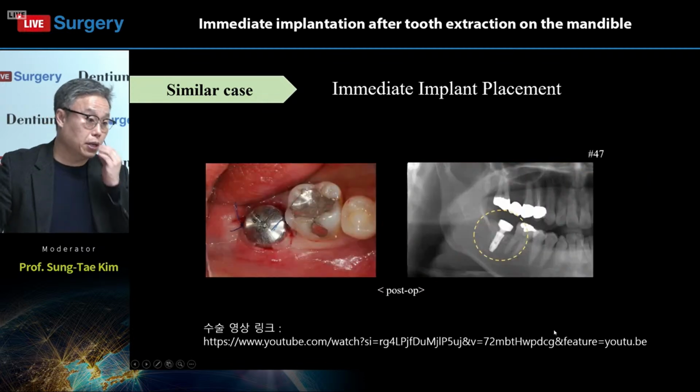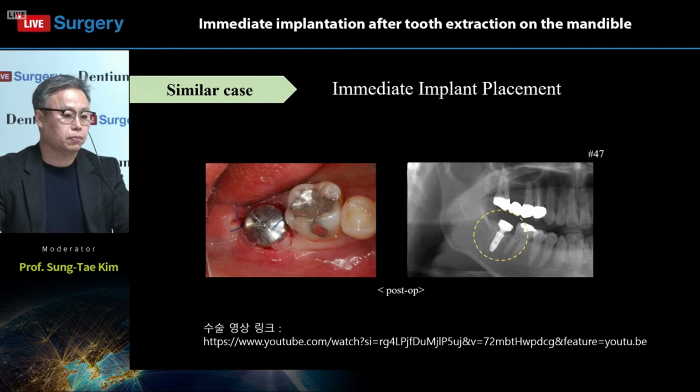You can also find the video following this link, and also use some healing abutment like this. Some people, like Dr. Lee, like using a healing abutment with a large diameter like this.